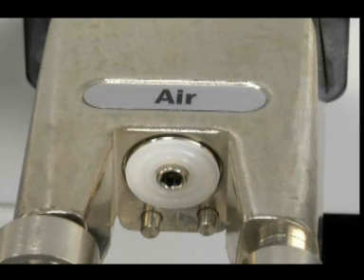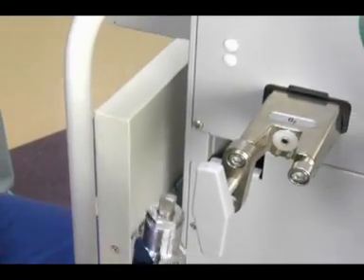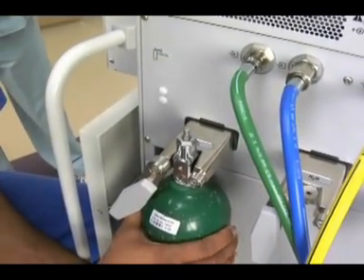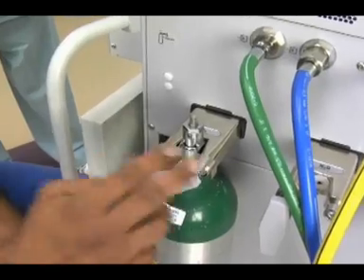The Pin Index Safety System, PISS, also part of the hanger yoke, prevents misconnection of a cylinder to the wrong yoke. The PISS system has two holes in its cylinder valve that connect with corresponding pins in the yoke of the anesthesia machine. The specific positioning of the pins and holes corresponds to a specific gas. The oxygen pin index is at 2 and 5, and nitrous oxide is at 3 and 5. The cylinders that are connected to the yoke assembly are oxygen, nitrous oxide, and air.